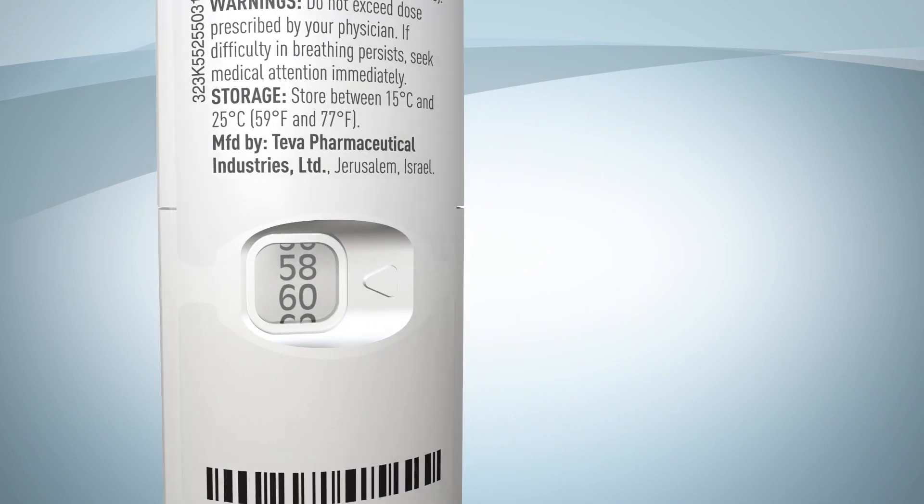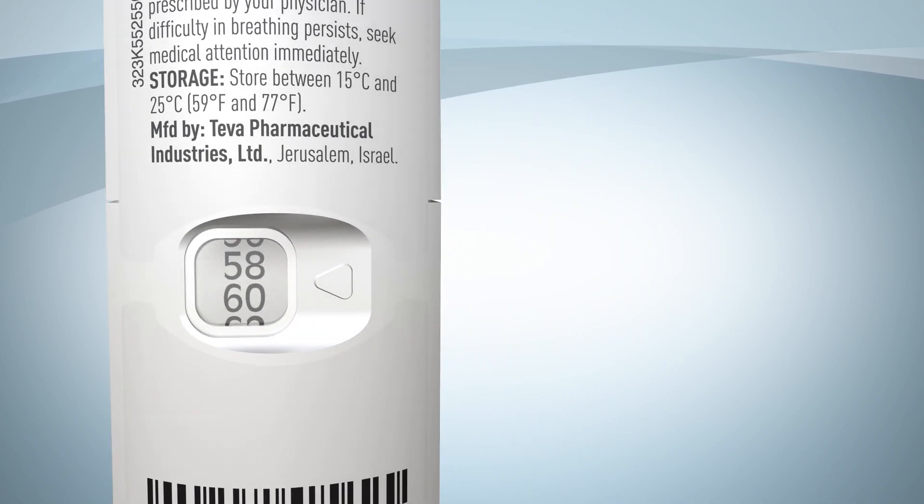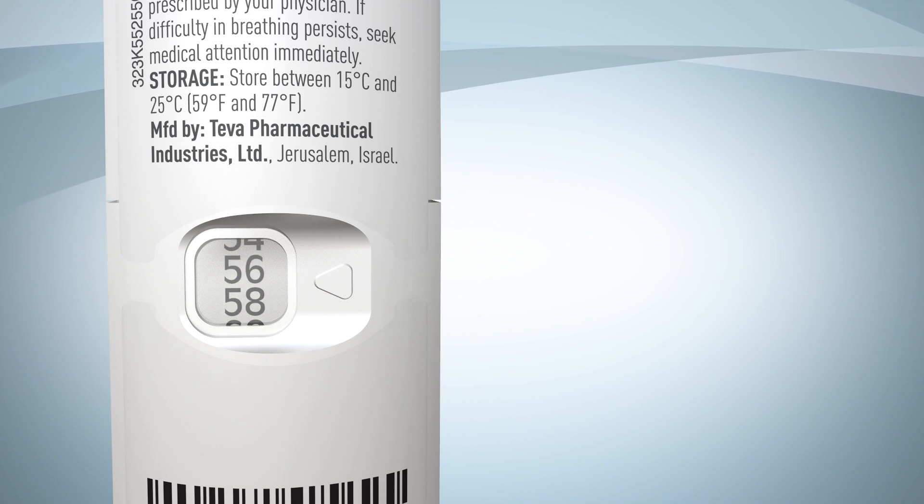When you close it, you'll see on the back that the dose counter tape moves down to show that a dose has been prepared and also to indicate how many doses are left in the inhaler.